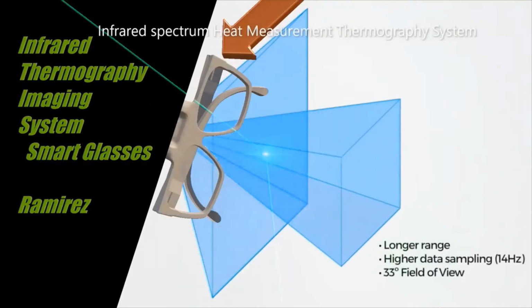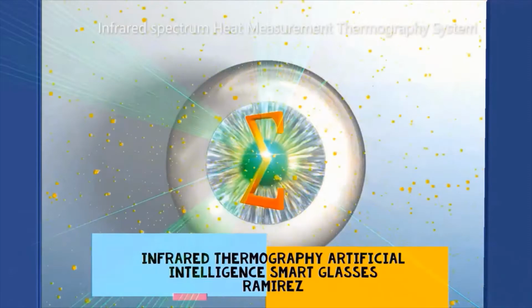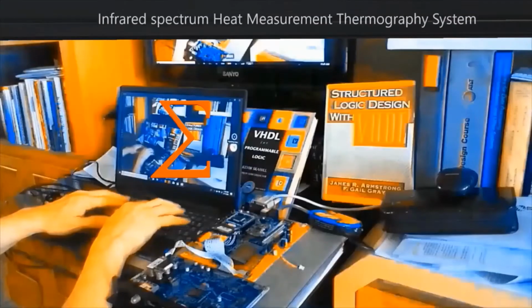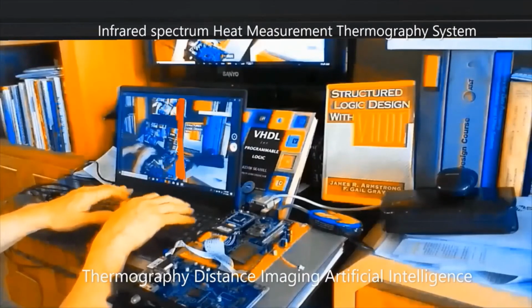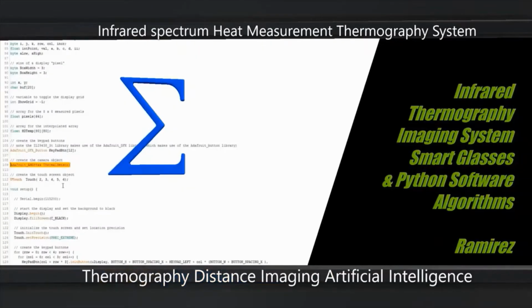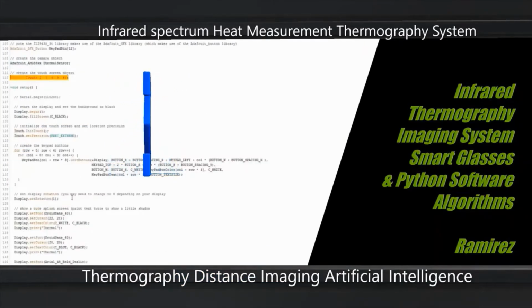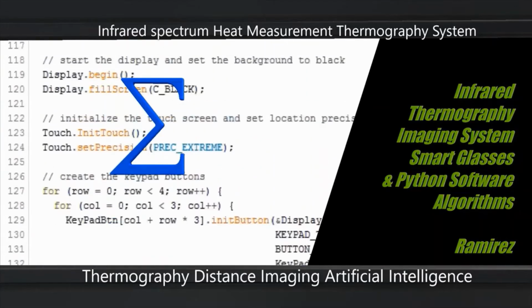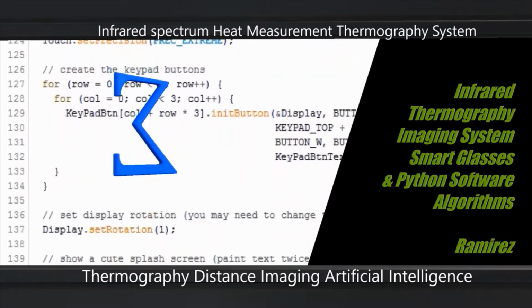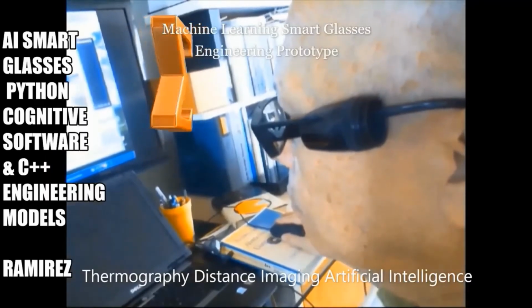The temperature of the bolometer changes its resistance, which in turn is converted into an electrical voltage signal, with fast 14-bit analog to digital converters to digitize the previously amplified and serialized video signal, as illustrated in this video presentation.